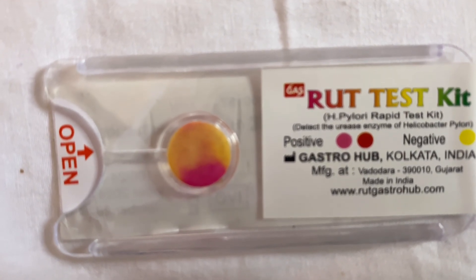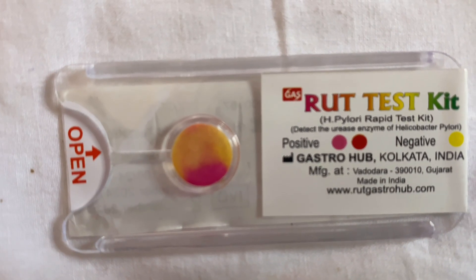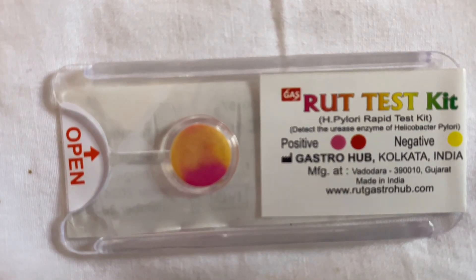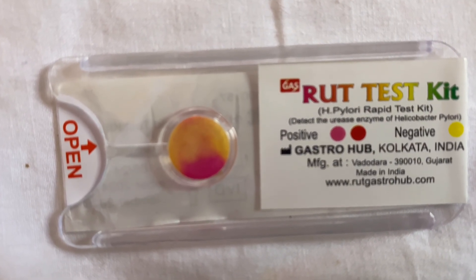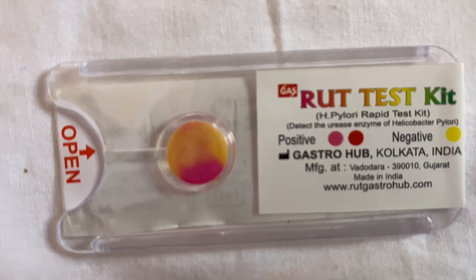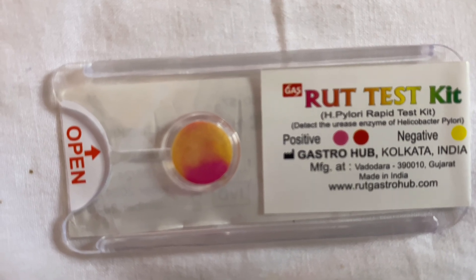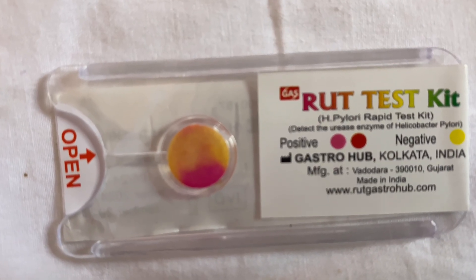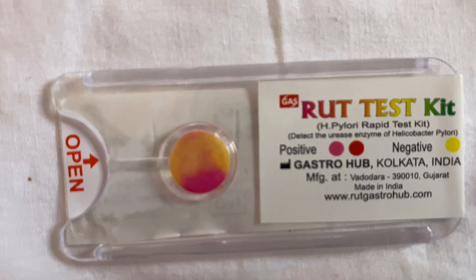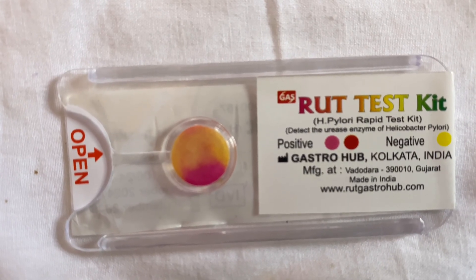When we add tissue from the stomach, especially from the corpus or the antrum, if that tissue has H. pylori, it reacts with the urea and produces ammonia. Ammonia is a base, and so the pH indicator in the kit turns pink or red when the pH increases — that is, when ammonia is produced and alkaline media develops.